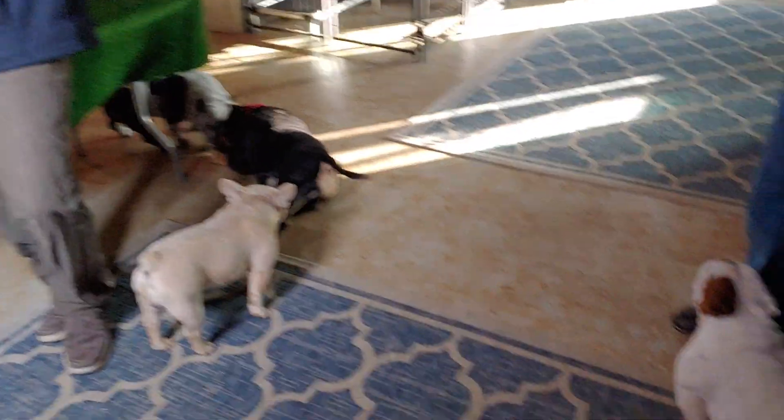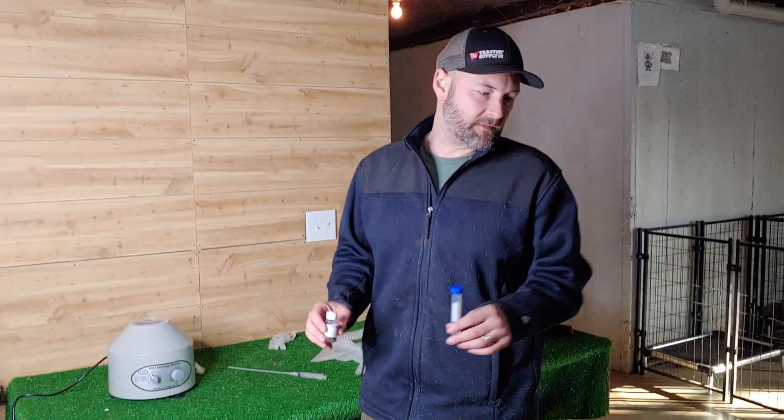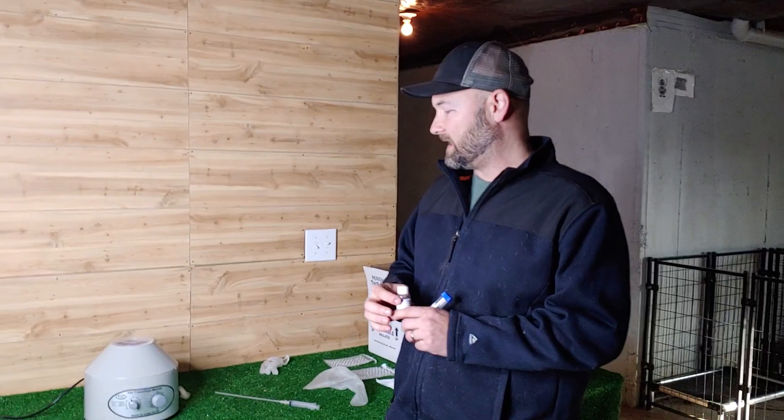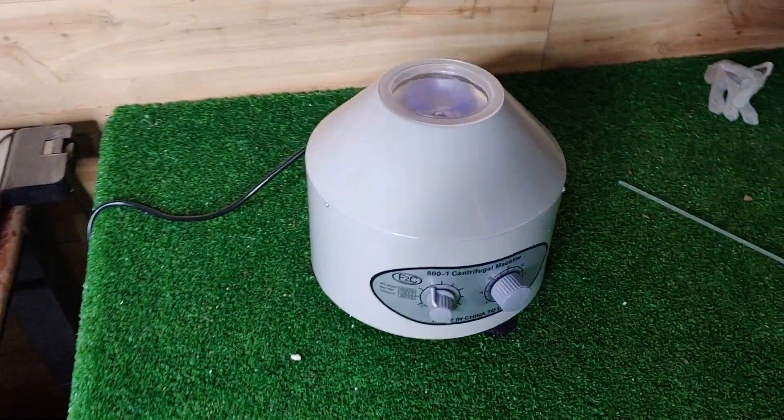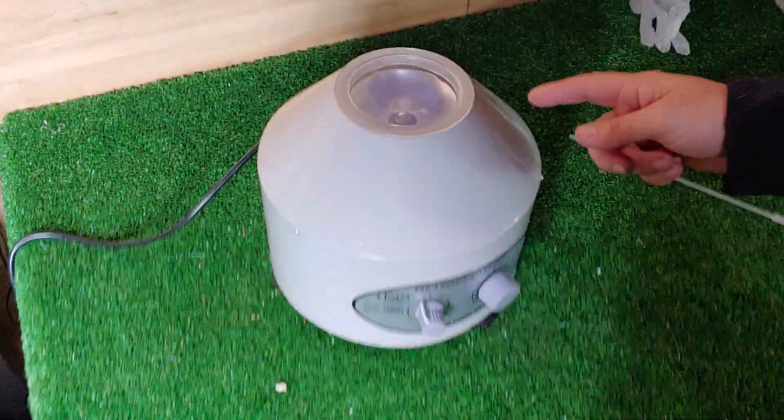We tried many milk-based powdered extenders, we tried different semen extenders that vets use, and none of it worked like this stuff. When you combine it with removing the excess seminal fluid and then adding this extender, it's really great. This centrifuge is a great investment.